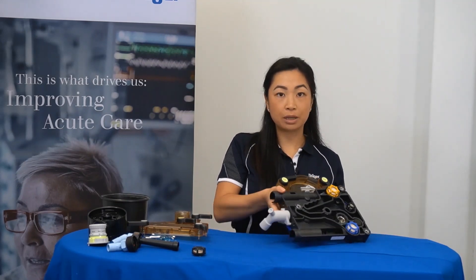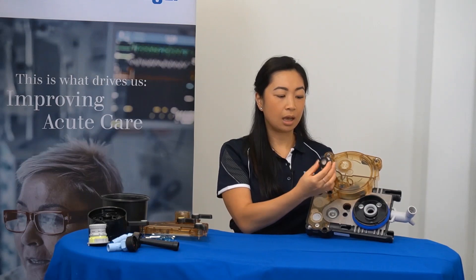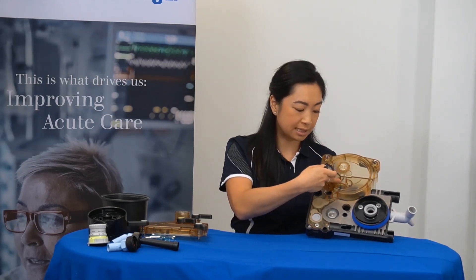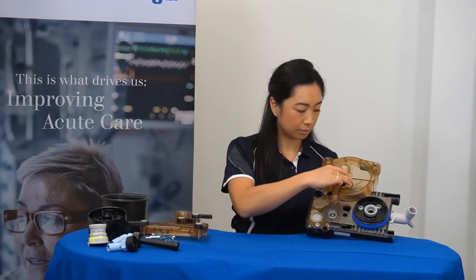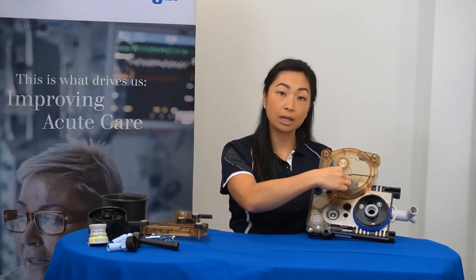By turning the breathing block around to the underside, you can then return the decoupling black valve to its position. Once again, aligning the notches of the valve to the notches here. Pushing down and remember a slight clockwise turn to lock it into position.